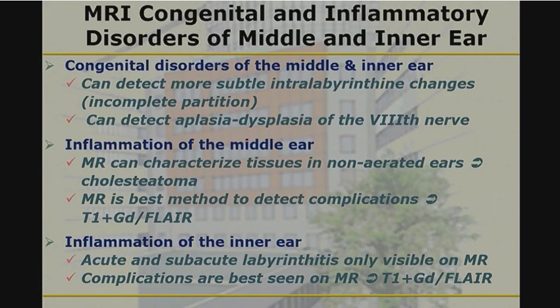Yeah, okay. I have a question about the cisternal segment of the cranial nerves. We see these days the clinician asking for the vascular compression over the cranial nerve. What's the criteria? Because we see so many vessels coming around the nerves. So when should we consider those vessels as compressing nerves that are causing the neuropathies?